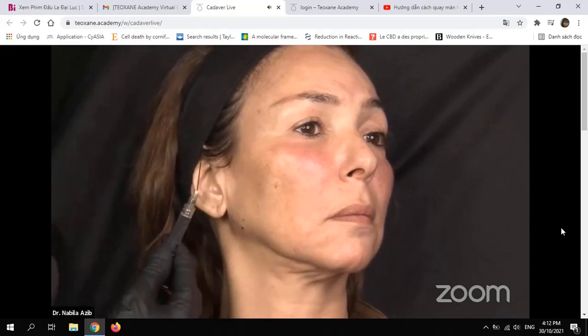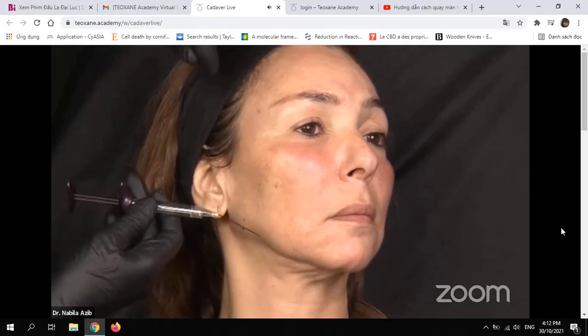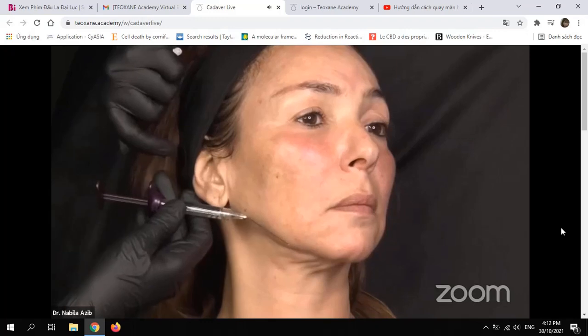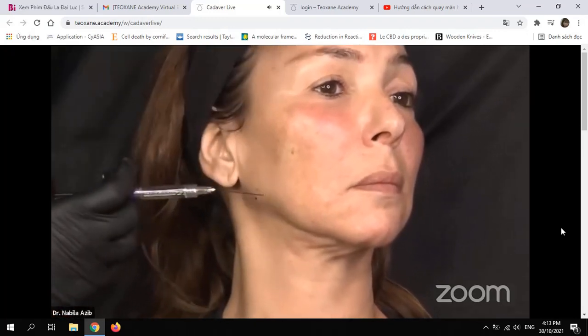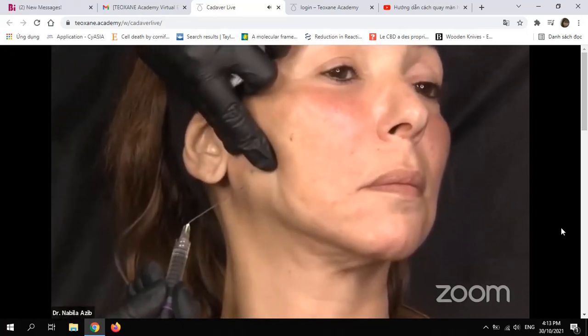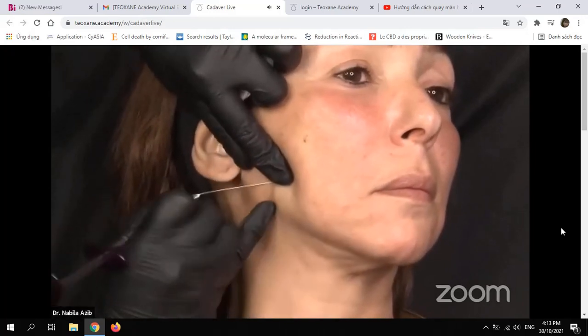So why do I bend the cannula? First is to be more comfortable on my injection, to avoid any earring or hairs. And the second is to do like Patrick was describing for hand rejuvenation. He was bending the cannula in order to be the most superficial possible.